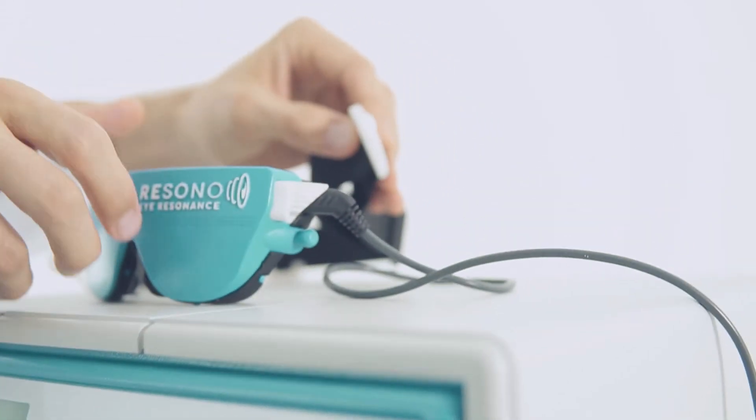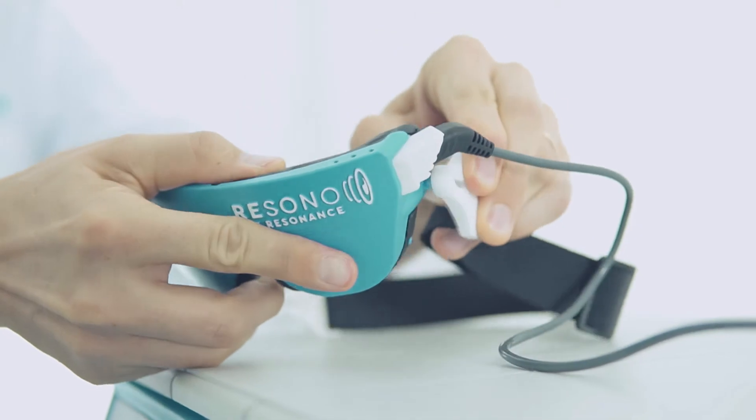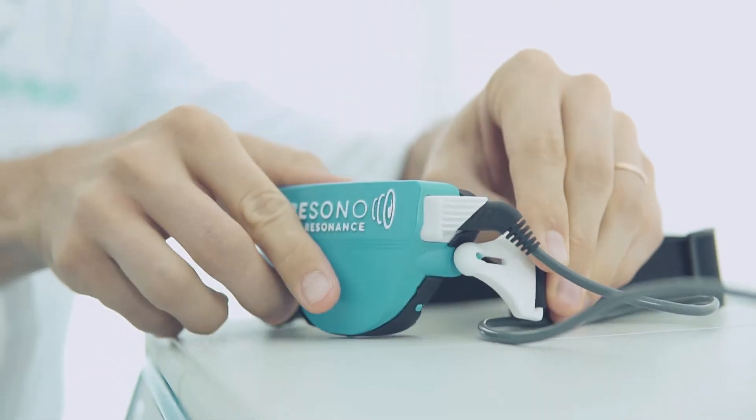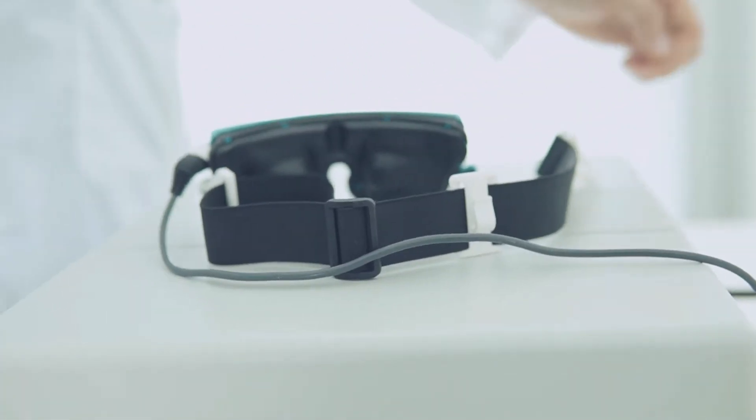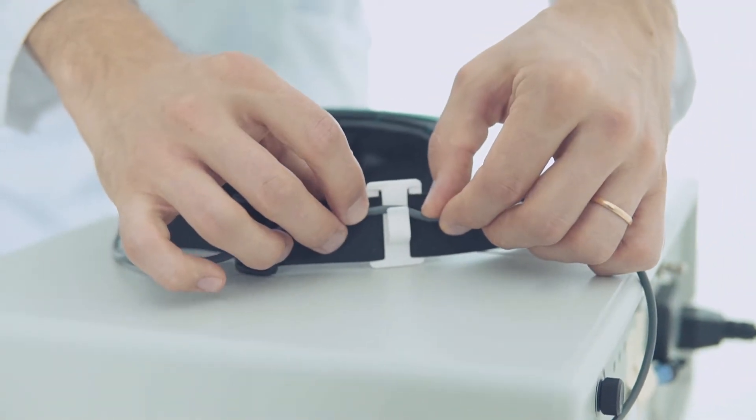Attach the elastic band to the mask by applying circular movements in order to help the connection. Connect the cable behind in the holder to balance the mask.